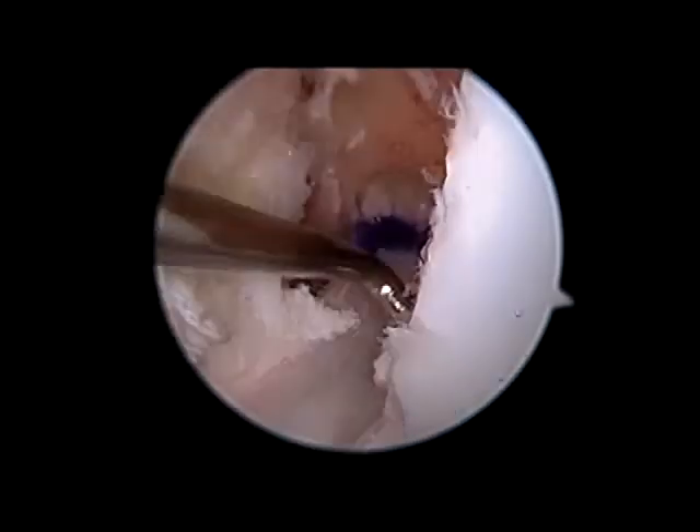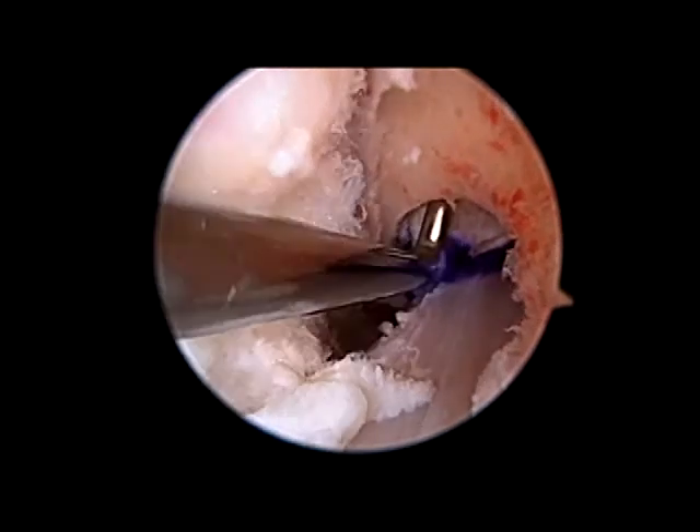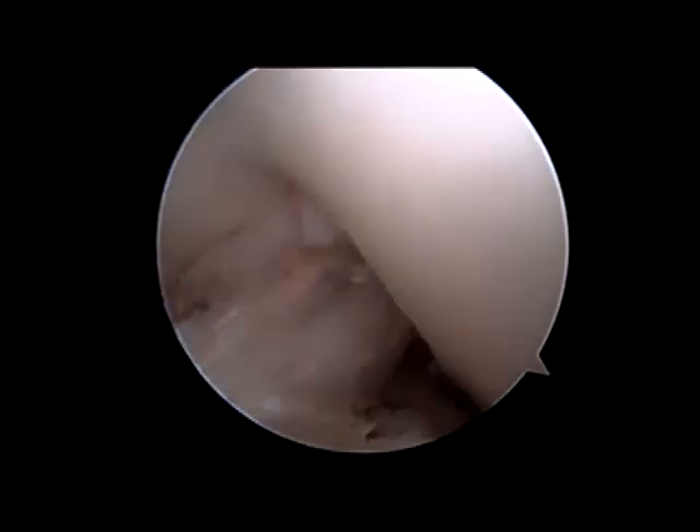The ACL graft is passed through the tibia and into the femoral tunnel. Once it is in proper position, the rigid fixed system will be used to lock the graft into the femur. The knee is then taken through a full range of motion. The graft is secured on the tibial side with a screw. The stability of the knee is checked. The patellar defect is bone grafted. The wounds are closed and the long rehab process can begin.